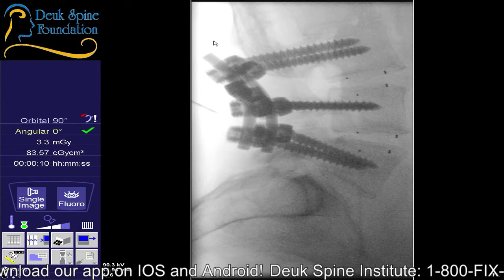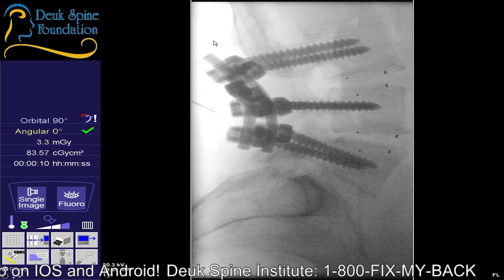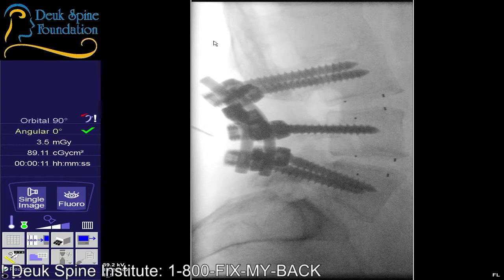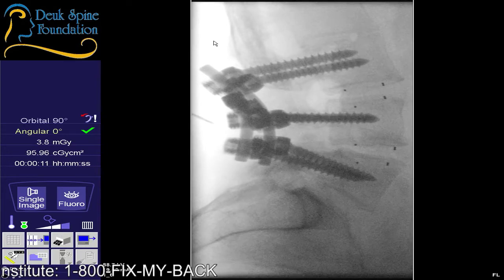Go further north, further right there, stop, and now lock the base and release the wag, and I'll bring the wag down, and shot. That's close. How about that right there, shot? Anything better or worse? Hard for me to tell. Shot?